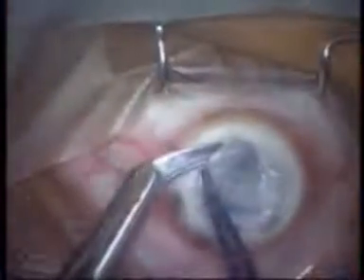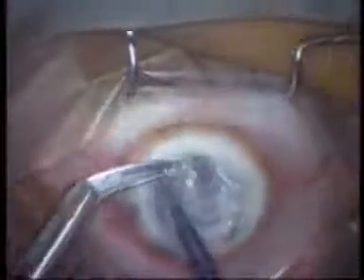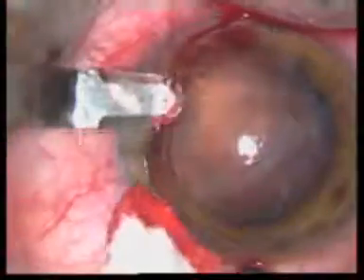Lamellar keratoplasty has evolved over the last 150 years; however, its utility as an optical procedure has been limited by problems of interface irregularity, scarring, and residual pathological stroma.